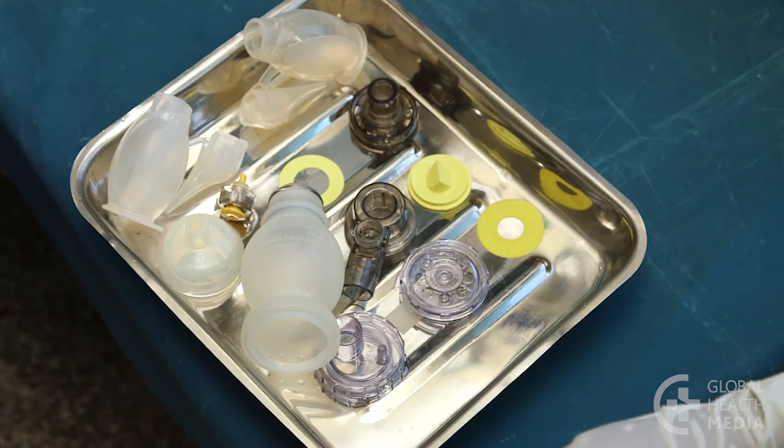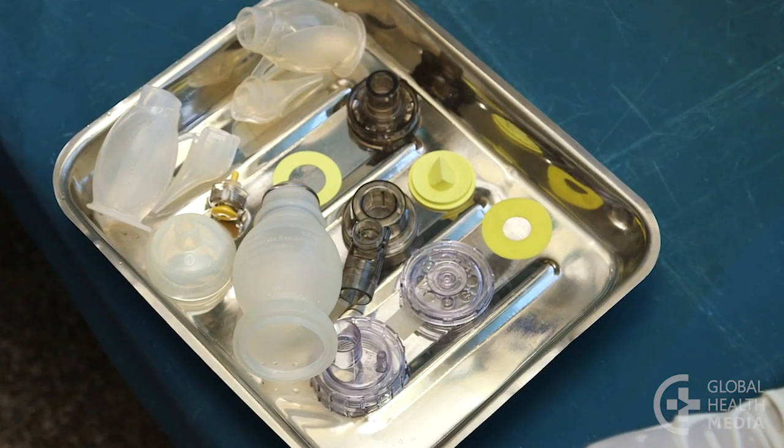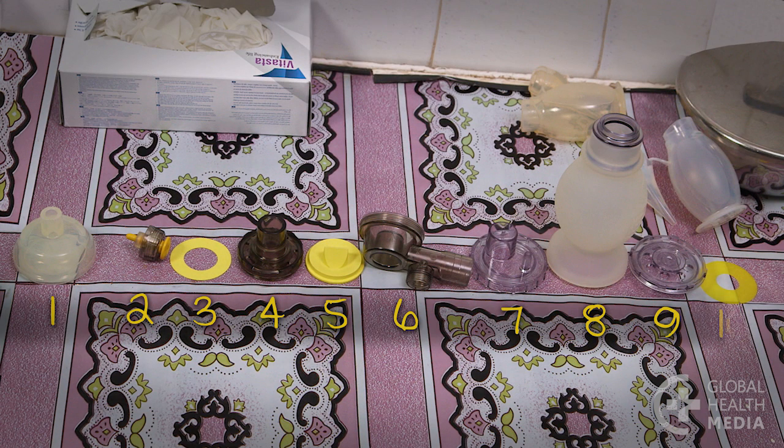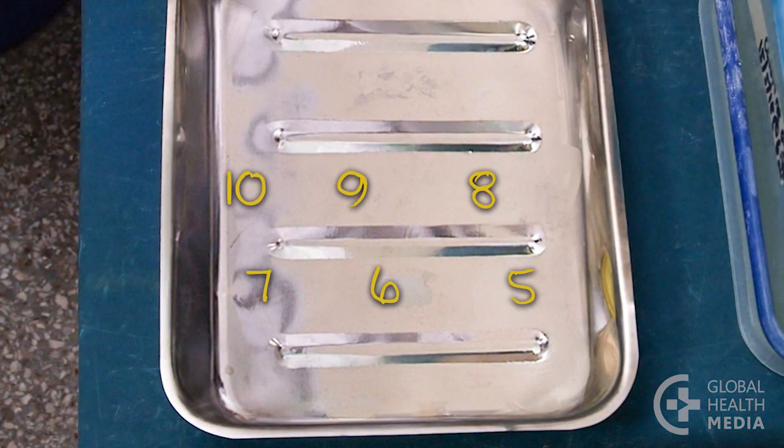Next, put the bag back together. Here's one way. Remember the order you took them apart. Start, then line up the pieces in the opposite order. Start with the last piece.